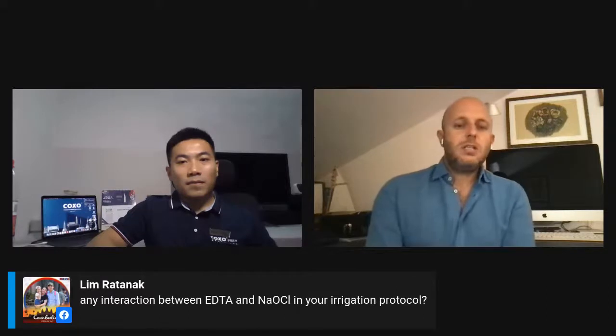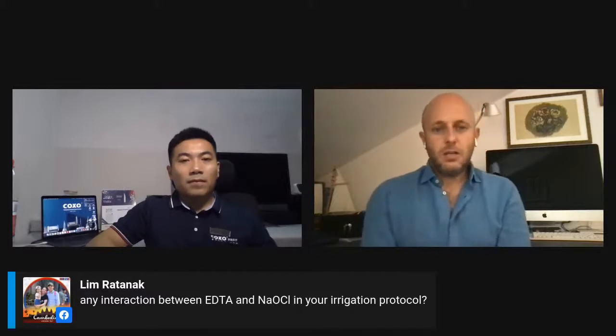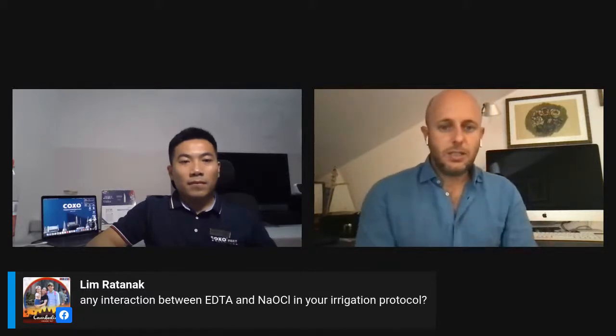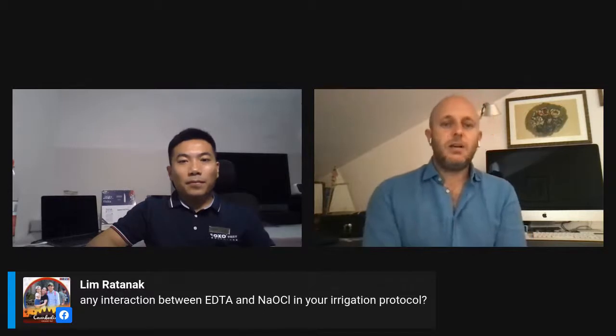So when you rinse, some endodontists suggest to do an intermediate rinse with saline to remove the EDTA and then to put a new sodium hypochlorite solution after removal with saline. Honestly, I'm not used to do it. I rinse much more time with the new solution, because if I have sodium hypochlorite inside the root canal, I rinse with EDTA, and the first amount of EDTA extruded inside the root canal is inactivated by sodium hypochlorite. So I rinse more in order to refresh the EDTA, and I do the same when I use EDTA after sodium hypochlorite. You have only to rinse more in order to remove the inactivated amount of solution.